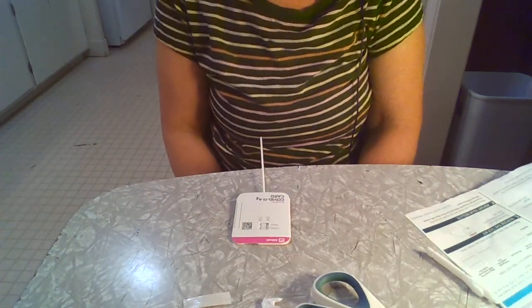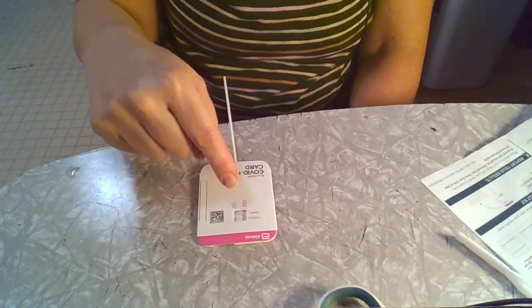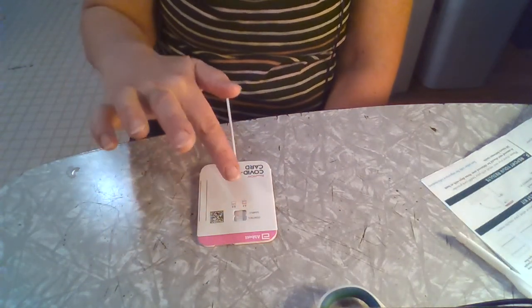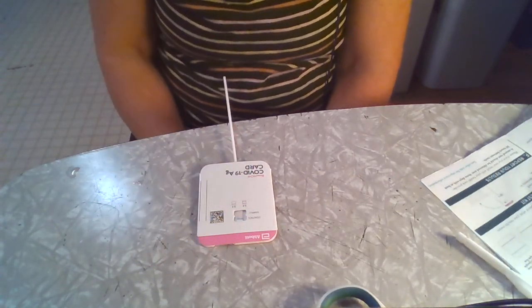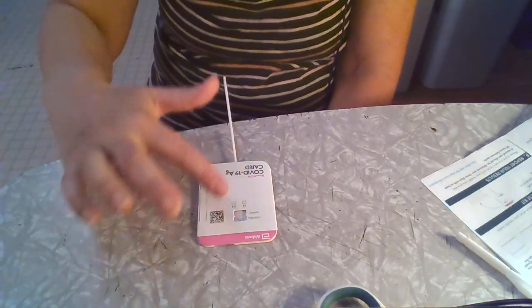Okay. Now we wait 15 minutes. Do not read the results before 15 minutes or after 30 minutes. Wait 15 minutes. And what happens is the liquid starts moving up into that line paper, and it'll do that for the next 15 minutes. So it moves up, it wipes out that blue line, and it keeps going. And then you don't have to panic about that, which I did panic about. So now the blue line is melting, kind of moving up the page. And that's okay. That's what it's supposed to do.